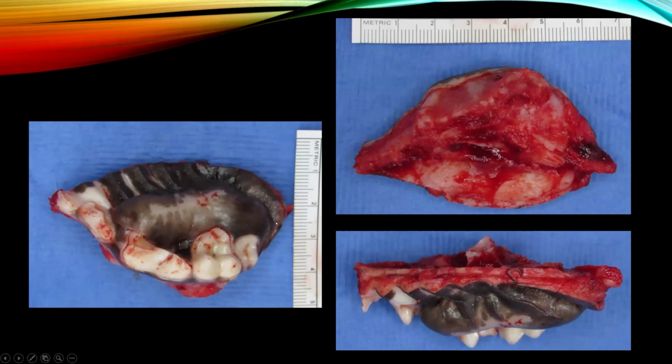This soft tissue margin, I was a little uncomfortable with that. That was a little bit close. So I did go back and remove a margin of soft tissue after this came out, just to make sure that we had a good margin all the way around. But you can see underneath that, we've got the full plate of bone. There's no teeth sticking through, no roots or anything. And it pretty much came out exactly as we had planned it on the original bone scan.